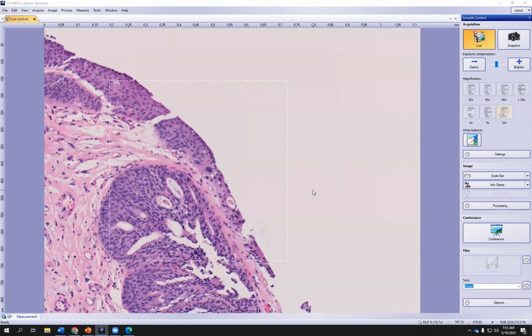That happens sometimes due to tangential sectioning, it appears as if the umbrella cells are in the center of the cell layer rather than at the top. So one has to be aware of that feature.